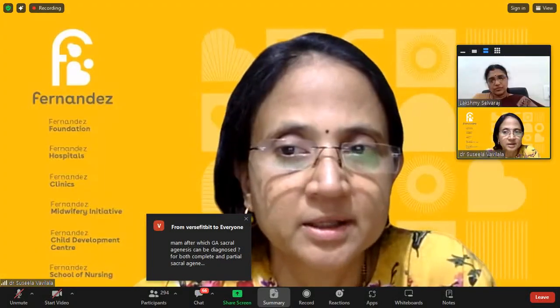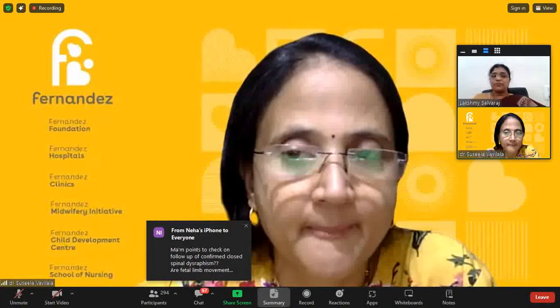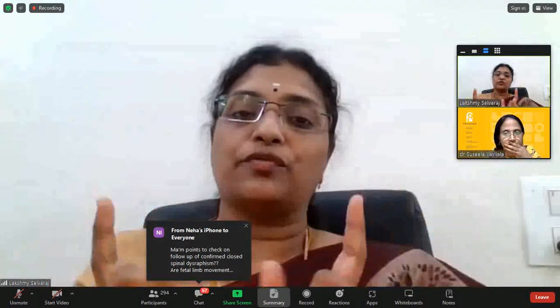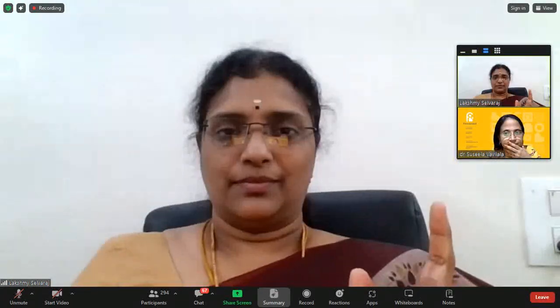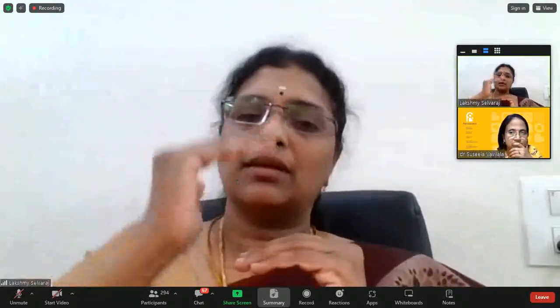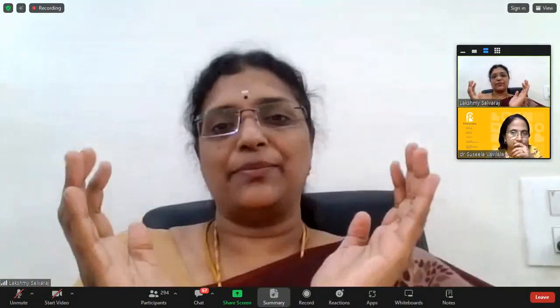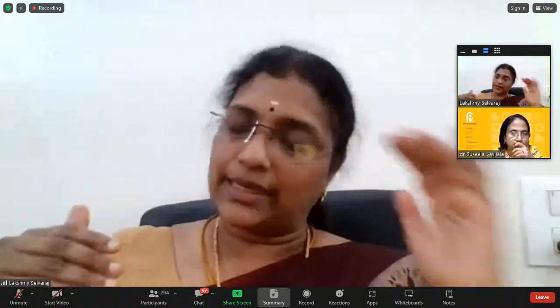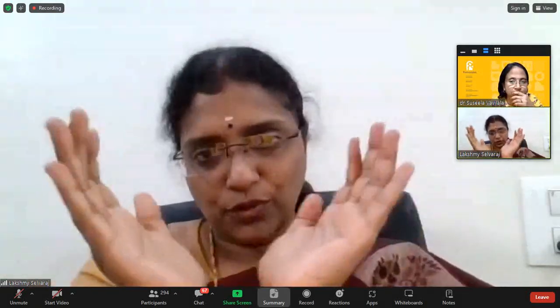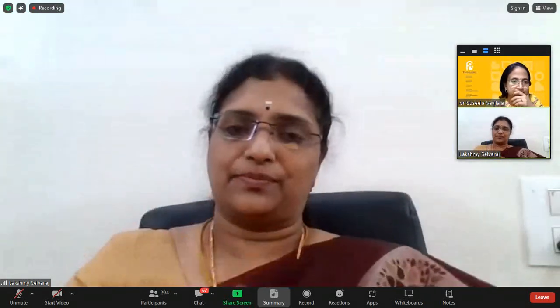If we see fluid behind the conus, can we rule out spinal dysraphism confidently? Spinal dysraphism can be evaluated in the axial section by looking at the divergence of the posterior elements of the spine. That is more important. For checking whether the cord is tethered or not, the fluid helps you. For spinal dysraphism, it is the divergent posterior elements of the spine. In all my cases of tethered cord syndrome and subcutaneous swelling, I showed you the divergent spine, because the divergent posterior pedicles are a clue for spinal dysraphism.